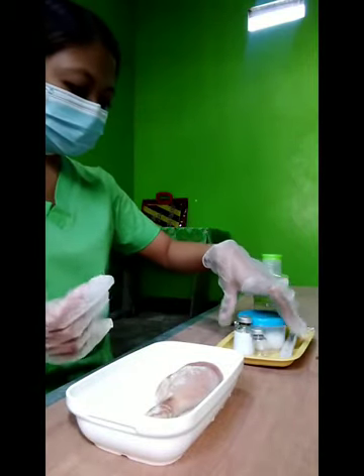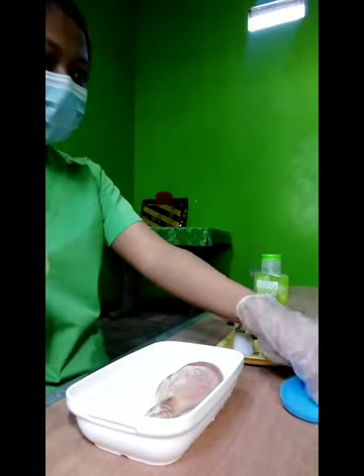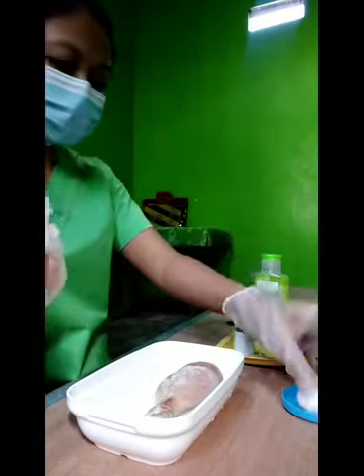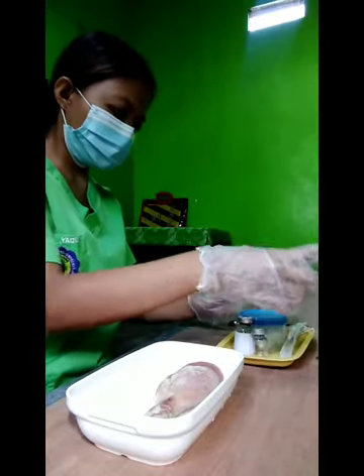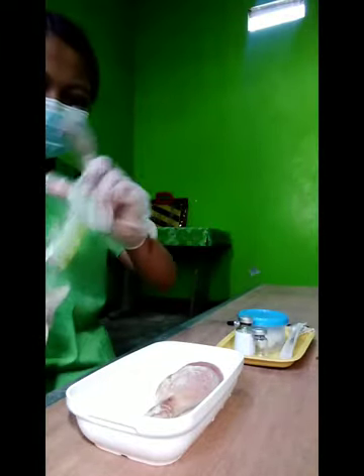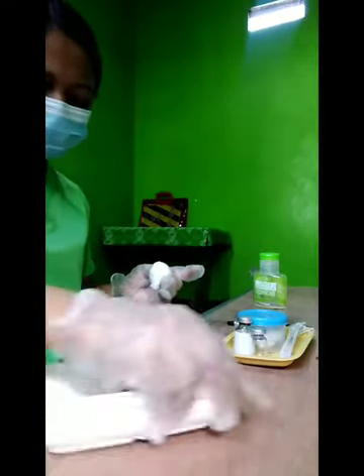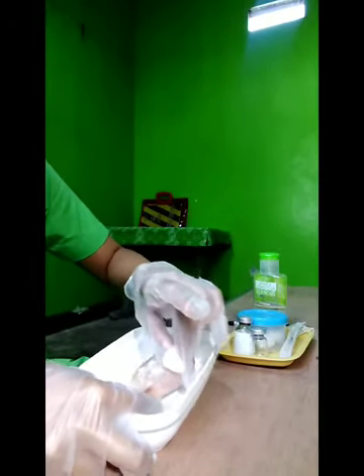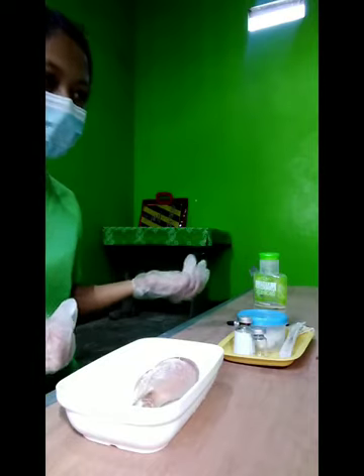Then cleanse the site with an antimicrobial swab while wiping with a firm circular motion. Then, allow the skin to dry.